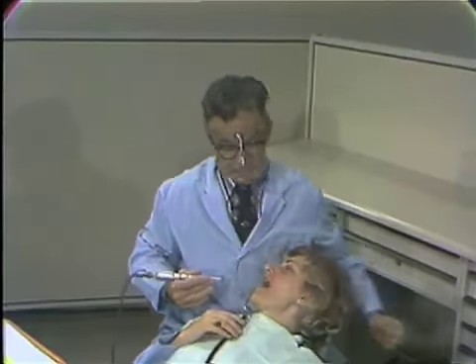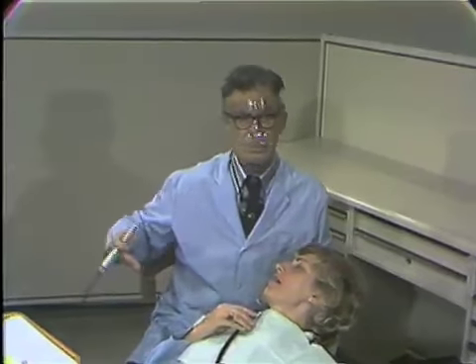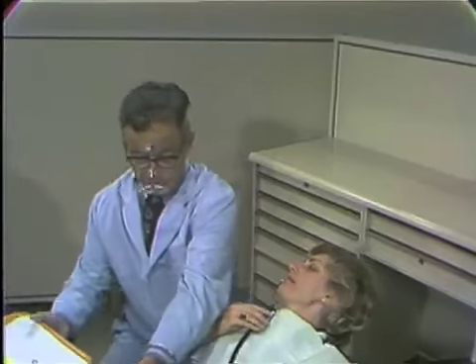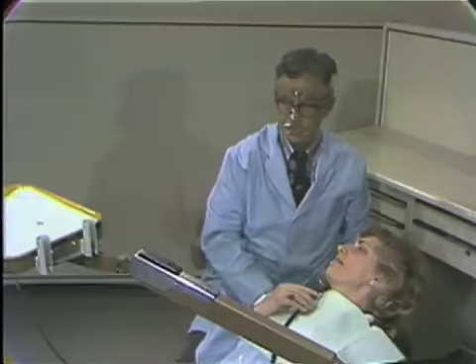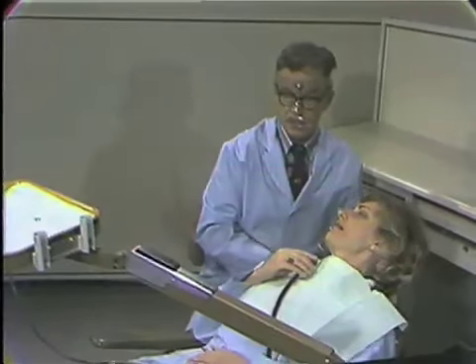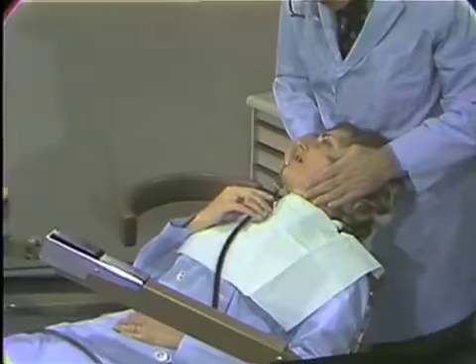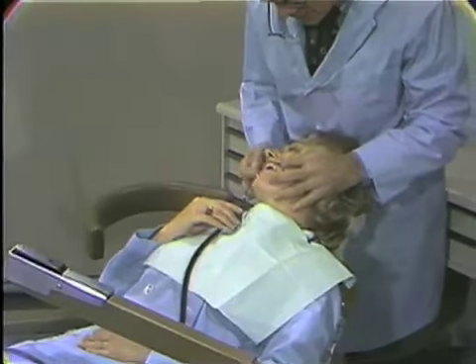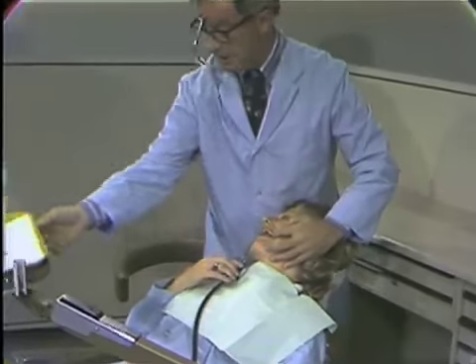We will now go to the upper left position, which requires a complete change of the patient and the operator. We have to move the bracket table higher and raise the patient. This is one of the few times that we do have to stand. Now, the patient's head is just about in the correct position. And as you can see, we now will have, again, good access. This is one of the most important things in this procedure.